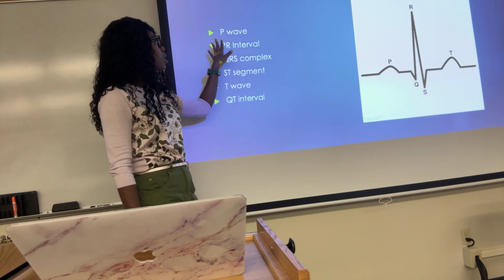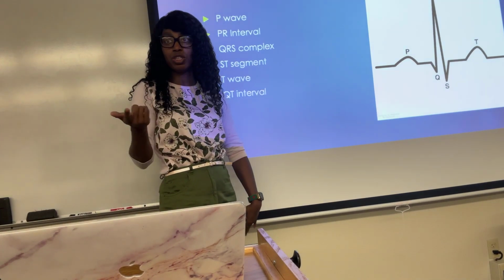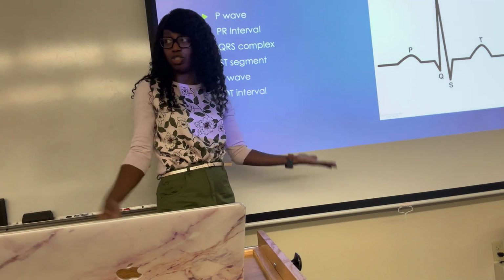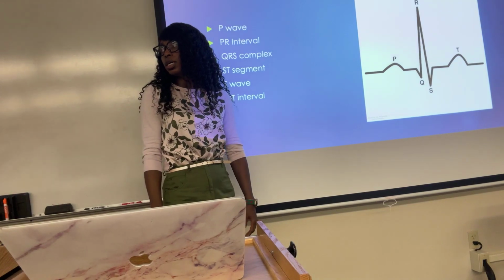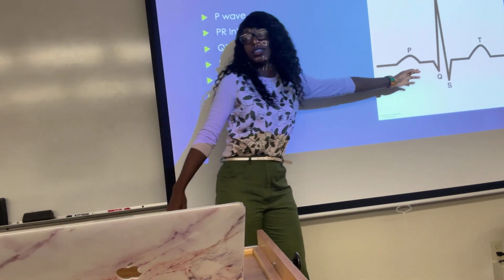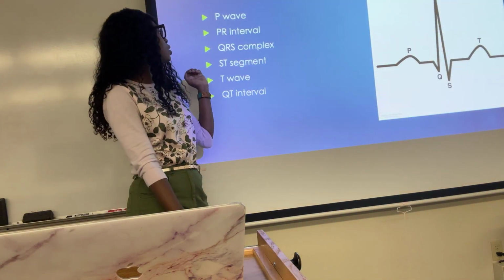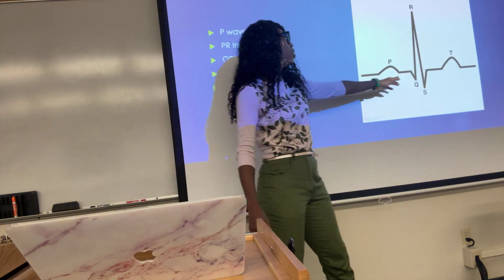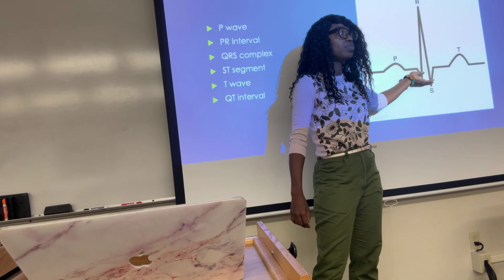let's remind ourselves, what does the P wave mean? Atrial depolarization, which is the same thing as atrial contraction, stimulation, yes. PR interval, mostly so from here to here, repolarization of the atrium, yes. QRS complex, this one right here, which one, what is this one? Tell us about. Ventricular what?